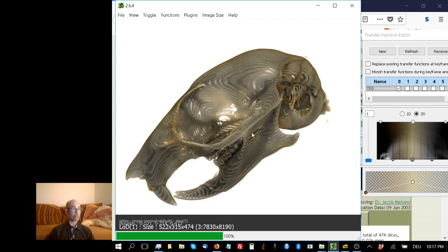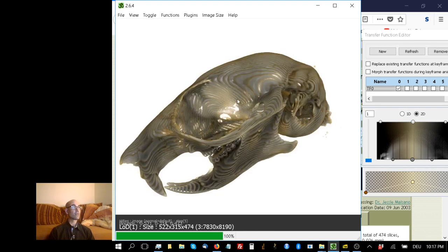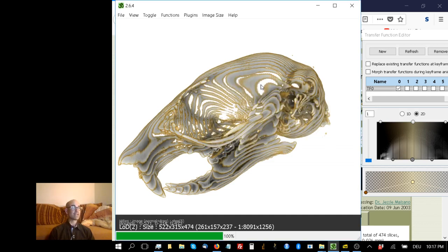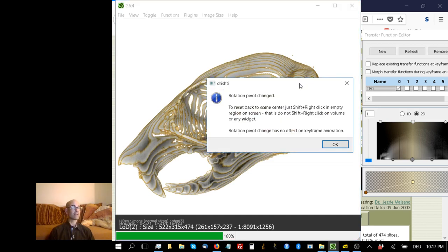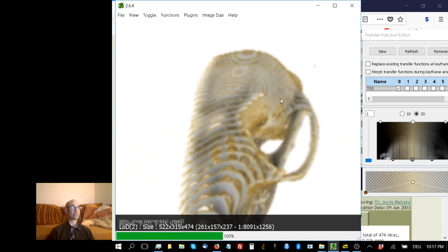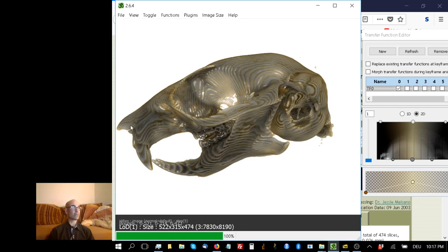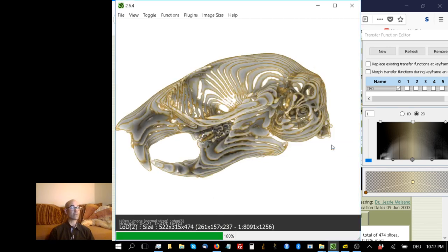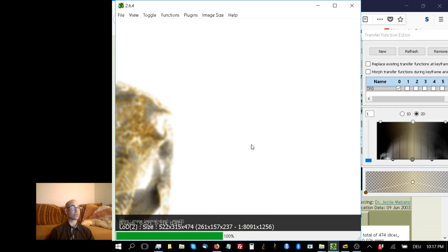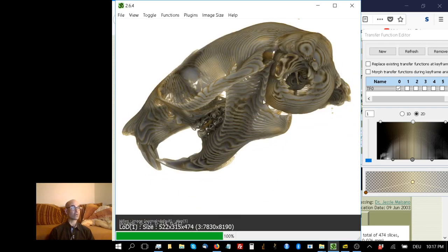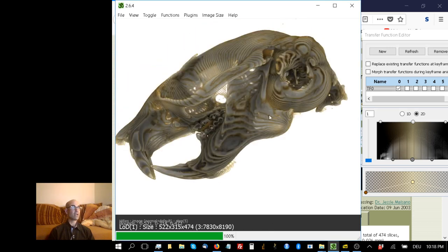If I want to change the axis of rotation, I hit shift right-click, and it changes the rotation pivot. Now it's going to rotate around that point I just clicked. If I want to move the rotation point, I hit shift right-click again. If I click in empty space, shift right-click, it's reset to the scene center.